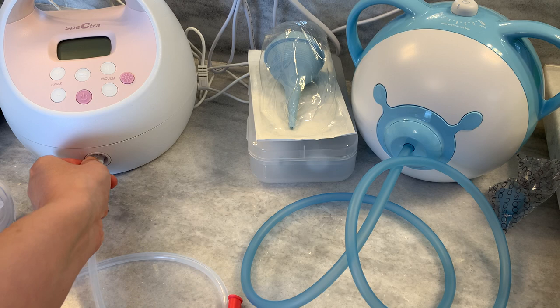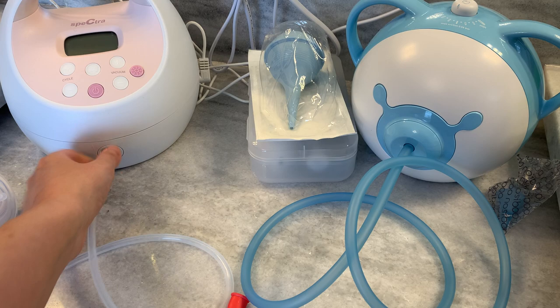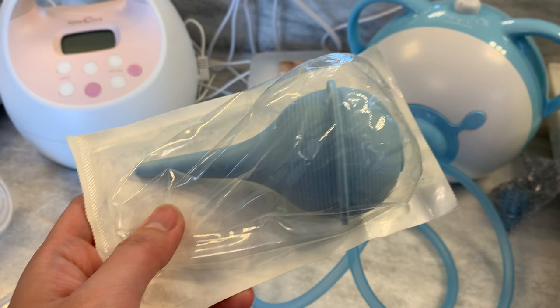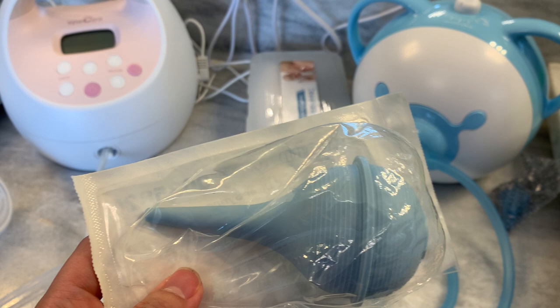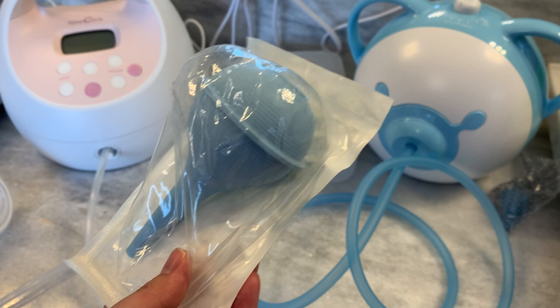Now we're going to move on to the suction bulb, which I don't use — which is why it's still in its packaging from the hospital. These retail for about a dollar on Amazon. You squeeze here, put this at the baby's nose, and release. I don't like these because it takes practice to get really good at it, and I don't like the lack of visibility. I love to see the snot come out and how much there is. It's also the most difficult product to clean, but for a dollar you can probably just get a pack and use one per illness.